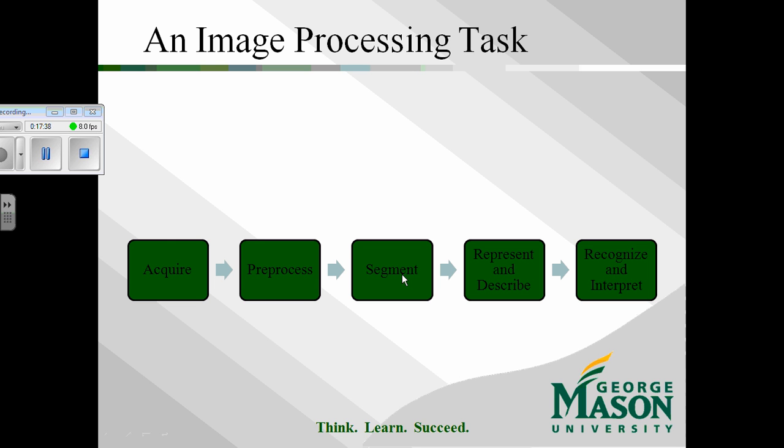You look at a time period of about a minute or two. You make sure you have that segment completely filtered. You convert it back into a plot, so now it looks like an ECG again instead of a list of numbers. And then a trained technician looks at it and sees the changes in shape that actually mean something.